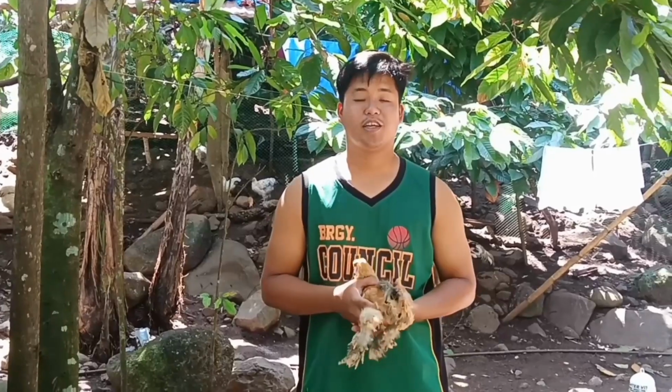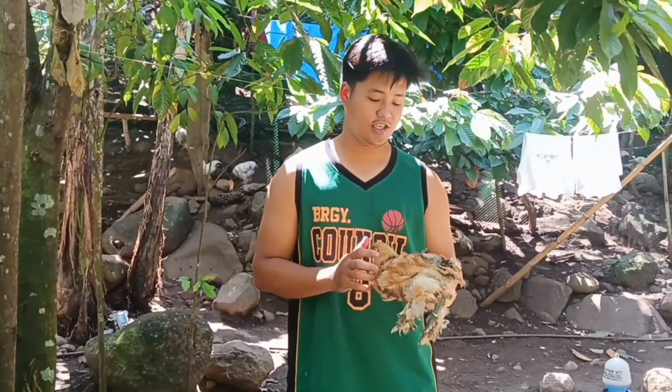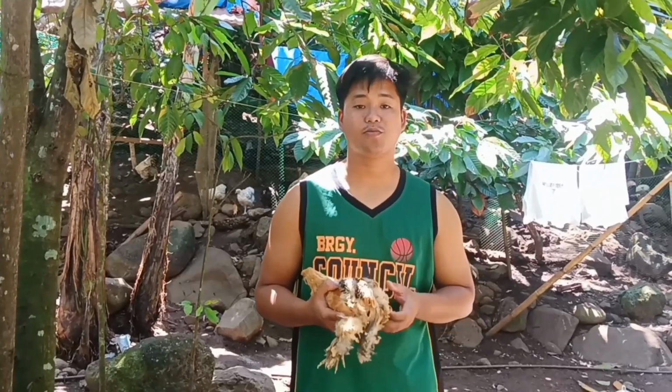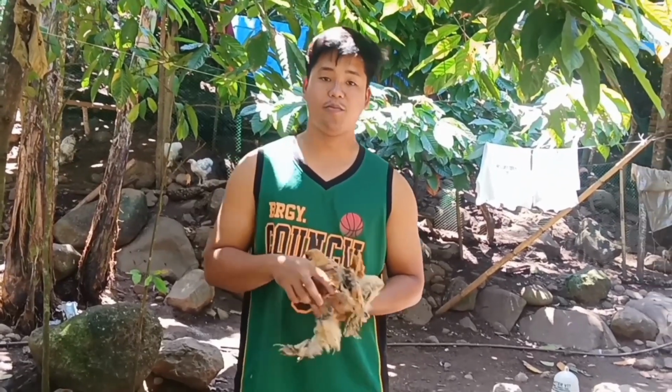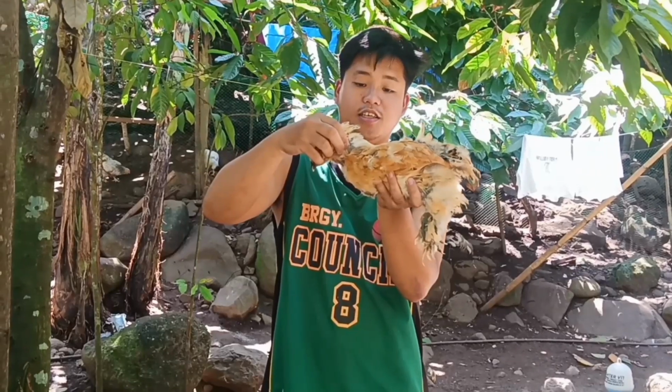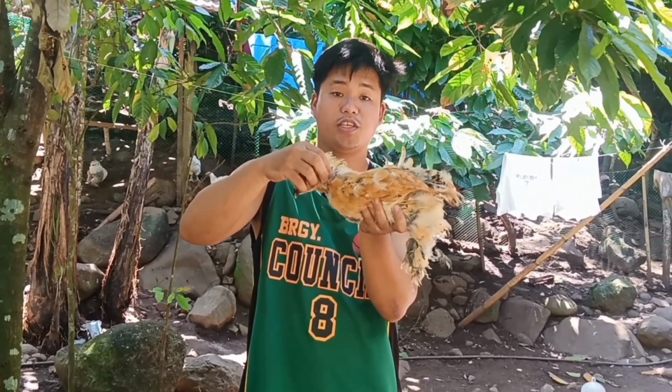So the first animal that we are going to inject is the chicken. For the intramuscular injection or the IM, you are going to find the muscle part of the animal, where you can find it in the breast or the leg part, but the suggested site will be the breast part of the chicken. And for the subcutaneous injection is the neck part of the chicken, the back part. The loose skin of the neck of the chicken is where you are going to inject it.